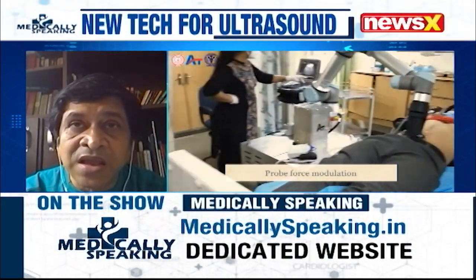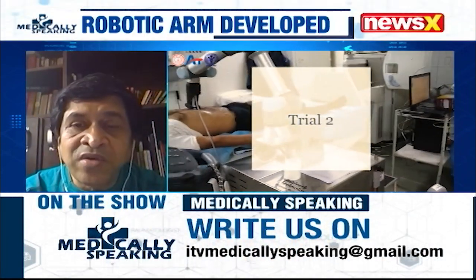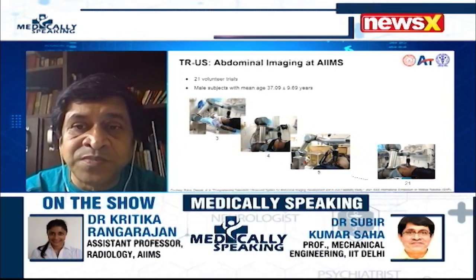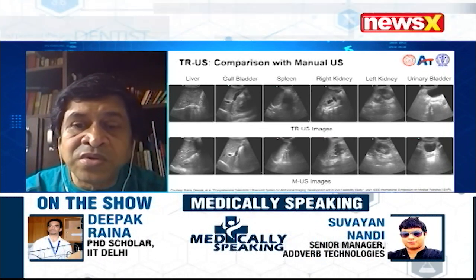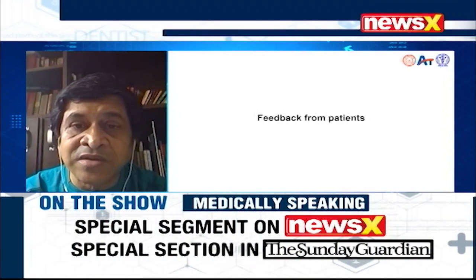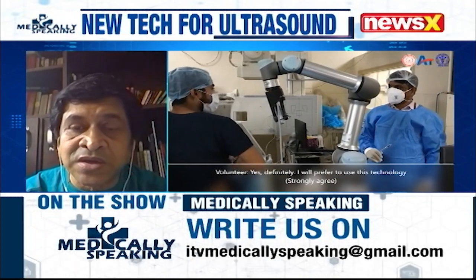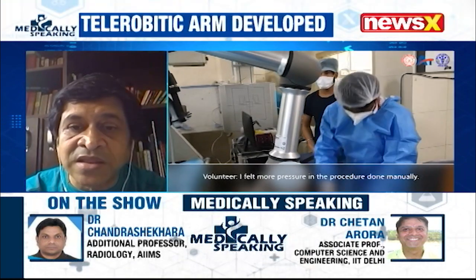The second aspect is to get a proper quality of the images, what we are talking about, ultrasound images, you have to have appropriate force applied on the body. So what we call is the force control. So here the challenge is to be able to implement force and position together on the robot. So this is a commercial robot. So we had to understand how the control aspects are done. And that was, Deepak and Subayan or their teams in Adverb, they made it happen based on the theories which have been learned over the years, in the literature. And Deepak, as a PhD student, has done that very well.